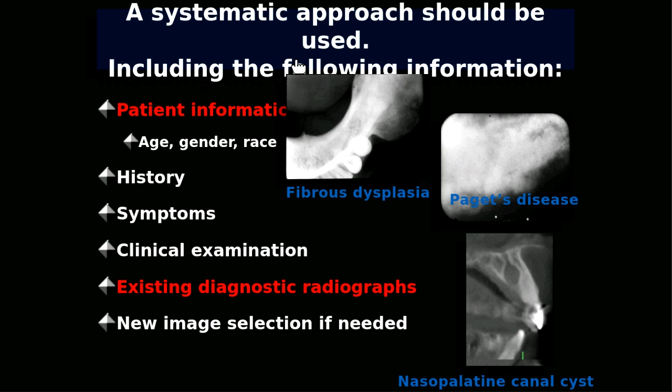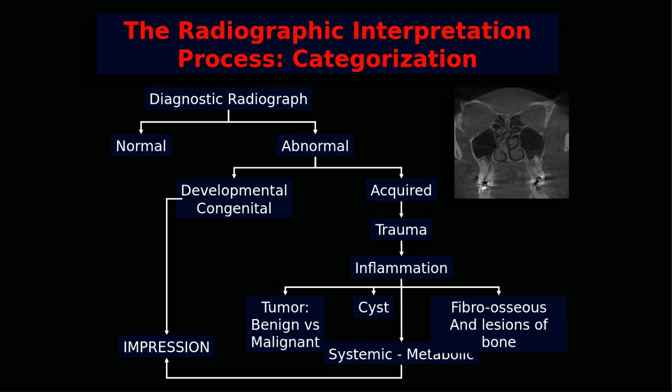And the other thing, which is very important: if you have the patient's previous information, or any previous history or signs and symptoms, those are very useful, so you can always use them. Please use your previous radiographic images and existing radiographs. Only then do you justify whether you need a CBCT, and based on that you can go for your CBCT scan or any other radiographic images.